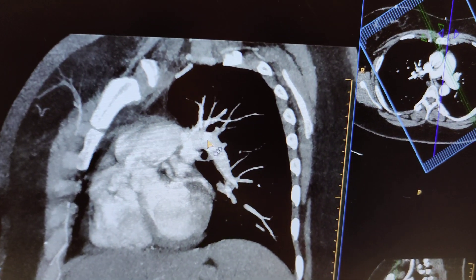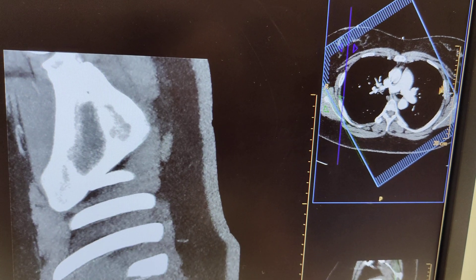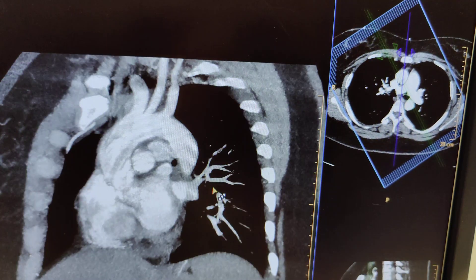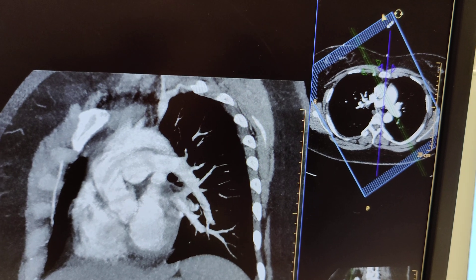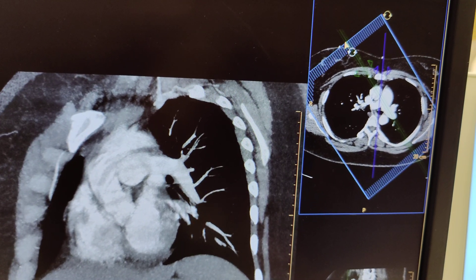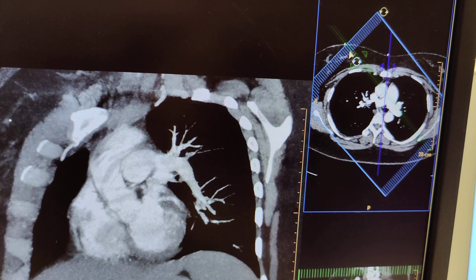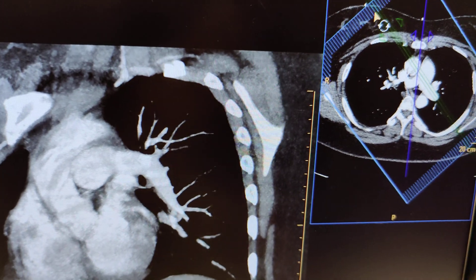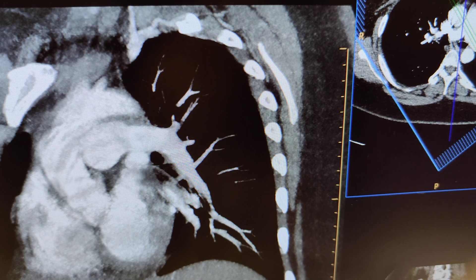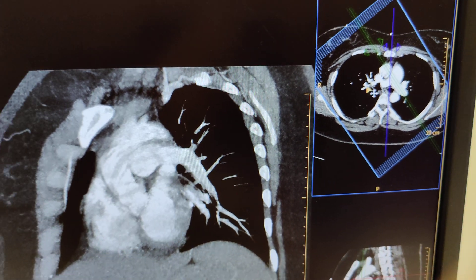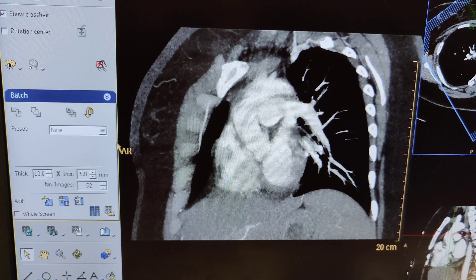Make sure the pulmonary artery is nice and elongated — here's the pulmonary artery. Make sure you get all your lung filled. If it needs to be rotated better, you can rotate it. See how rotating it changes the elongation of the arteries — just get some nice elongation and you're good. Then save it, label it, and move on.